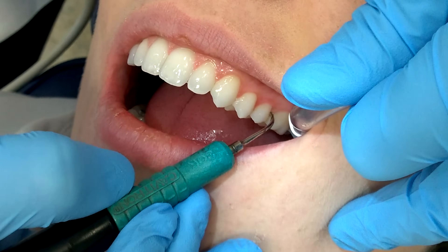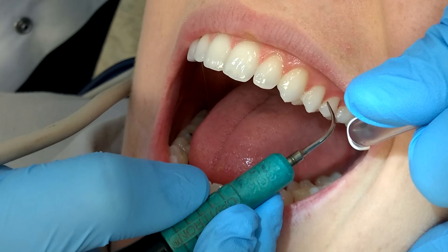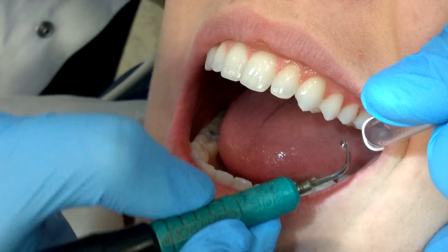If you ever see an area that is bleeding when you're using the ultrasonic, feel free to stay there a little bit longer and flush it out with the water. The cavitation also helps destroy the bacteria in the area, so this is a really good tool for those areas of gingivitis.